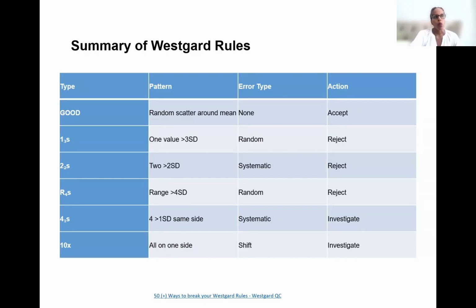So what I'm thinking about is that when you're running your daily QC, you're also doing trending over time. That trend in itself will also show you any patterns of shift or drift. And you should also be looking at the CV of your QC, how your QC is performing over a period of a week. And that will tell you what the performance is. Is the performance a drift, or is it a trend above the mean or below the mean? So it's really important to utilize all of those systems in assuring your quality before you run patient samples, while you're running patient samples, because the EQA will not pick up what's happening week to week.